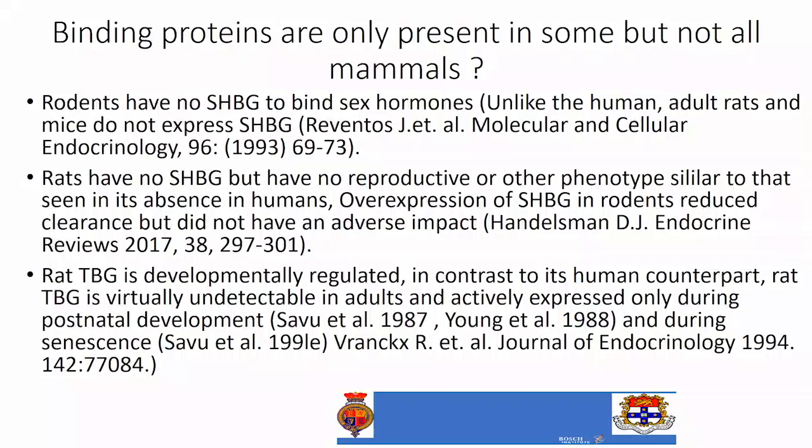He had a recent review in Endocrine Reviews where he was commenting upon a paper that came out, which is a standardisation by HPLC-MS/MS of free testosterone. It went through and compared all the immunoassays and showed that they were totally hopeless at measuring it in females, and we already knew that. It also showed that you could do it, but there was still no real evidence presented that free testosterone was the component that was most important rather than the total.